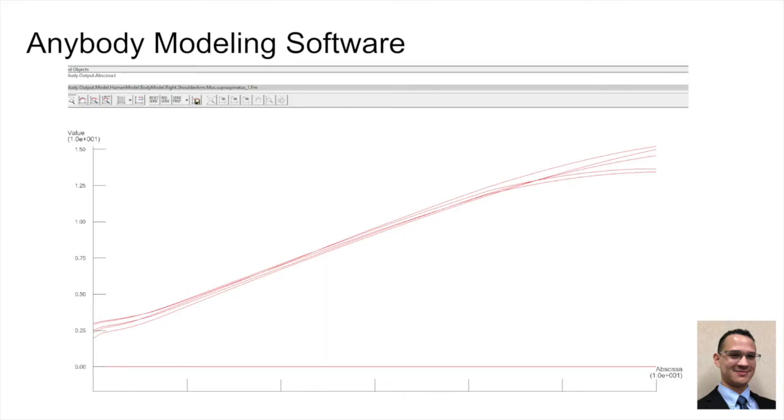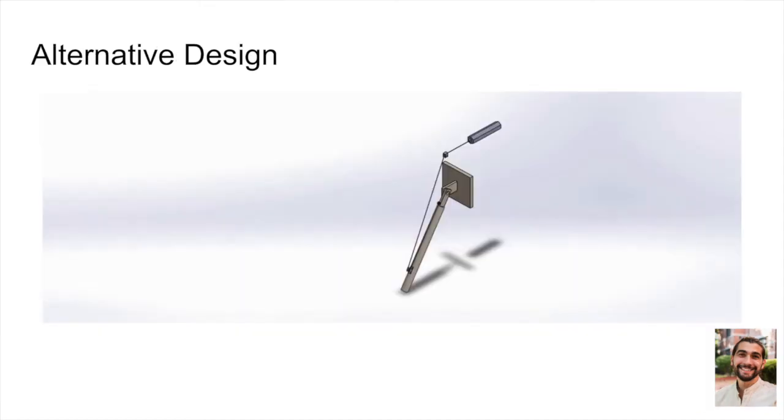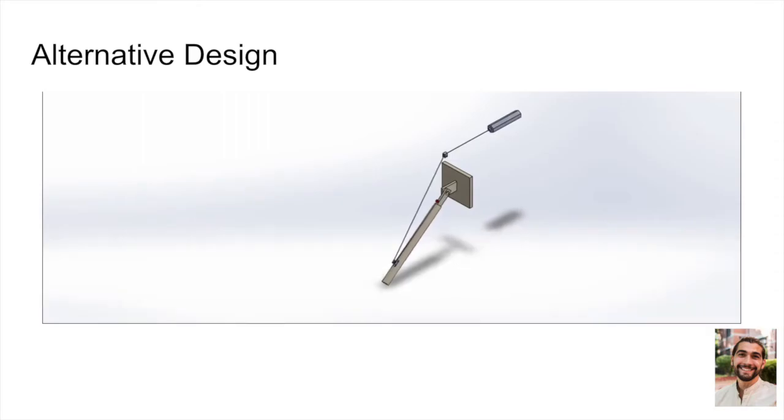So after doing some of our research in AnyBody and at UConn Health, we wanted to make the actual design. We started with this full model of the glenohumeral joint, but quickly found out it was far too complex for SolidWorks. Working with those complex geometries just doesn't work well. So we moved on to a one-dimensional version of the shoulder. This is really just a hinge joint, and all we want is pure abduction of the shoulder anyway, so we figured this was a close enough approximation.